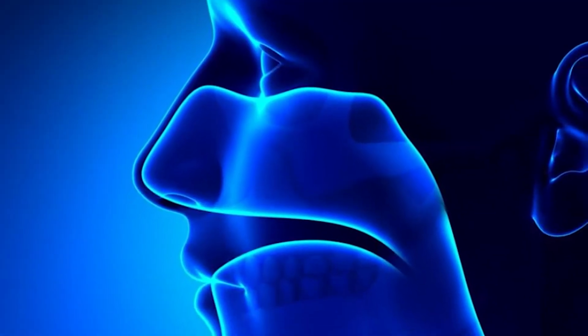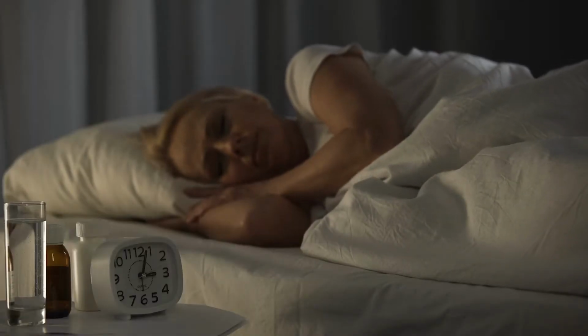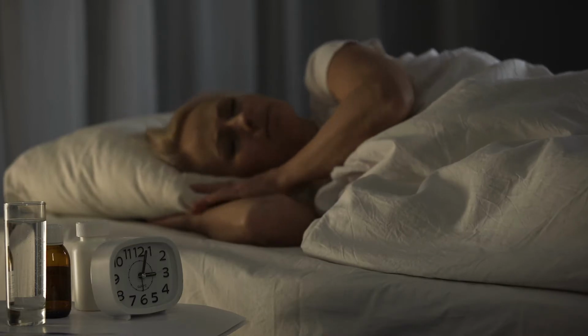And for people who have problems breathing through their nose, we can do a very simple procedure called a turbinate reduction. You can use a system called ablation, where again, the patients come in the office, this procedure's done here. They're done wide awake, talking to me, unfortunately listening to my dumb stories. And I basically use a small ablation needle and I destroy the turbinate tissue from the inside. It literally takes minutes to do. These are people that say, oh, when I lay on my right side, I can't breathe on my right side. When I lay on the left side, I can't breathe on my left side.